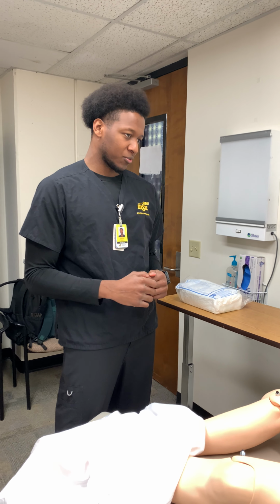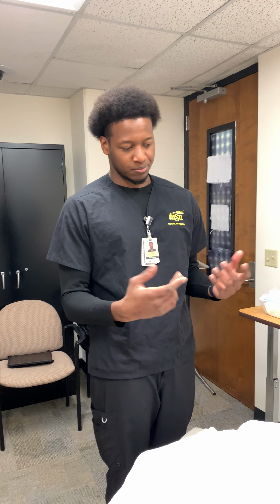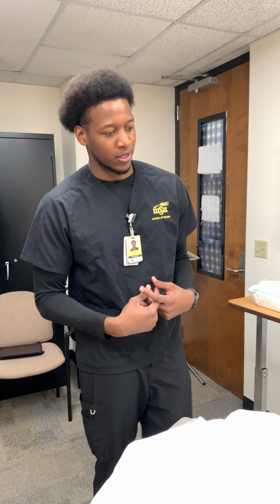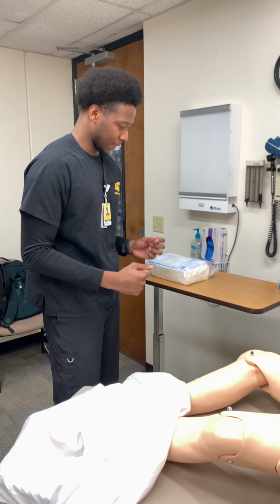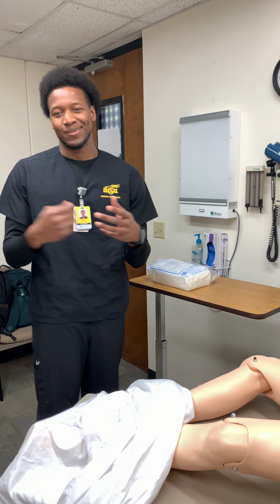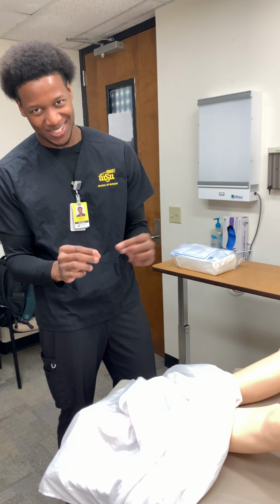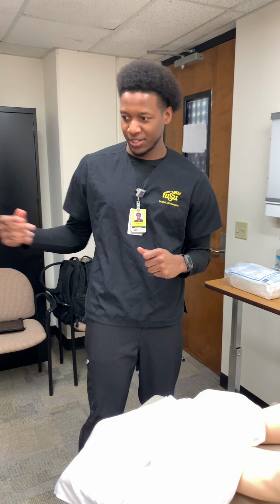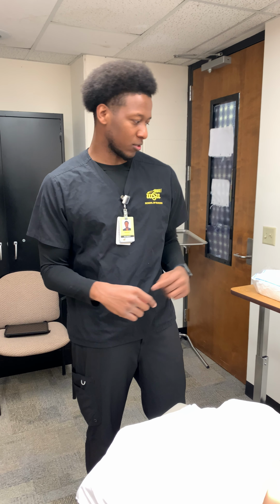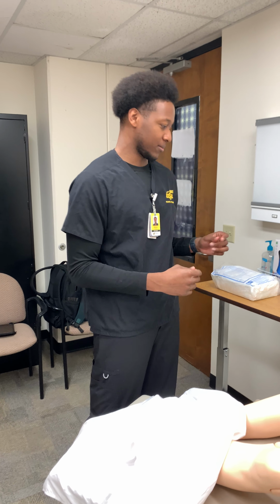So before moving forward, I also want to make sure I clean the patient, perineal care. With that, we can use soap and water. When we're using that, we'll just make sure it's not soiled down there so we can keep our sterile field sterile. After using soap and water to clean this patient, I will use gloves and hand hygiene, and also after. So in this case, I'll do hand hygiene, take the gloves off, and move forward with my Foley catheter insertion.